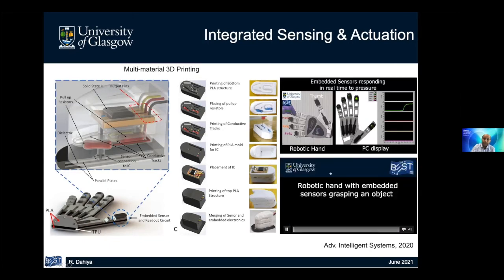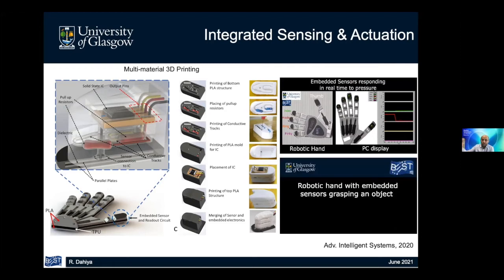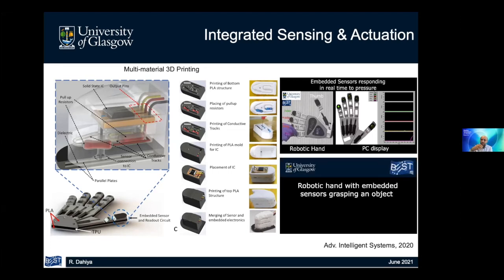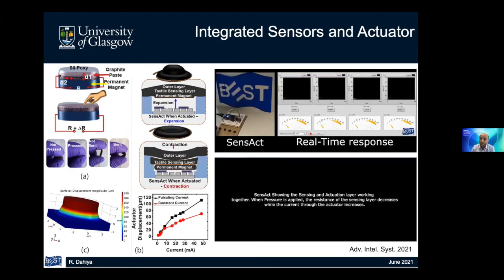Some videos are shown here. Recently, we reported this work where we are arguing that the structure itself can be a sensor. Because everything is embedded, in some sense it is also closer to our body. Everything is embedded here, like sensors, the receptors are embedded inside the skin, and skin is acting as a protective layer. In this case, the structure acts as a protective layer, and the structure is also sensing. So this can be taken forward, and some of the printed electronics that I mentioned earlier can also be used in combination with this.